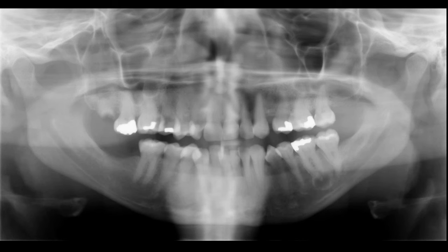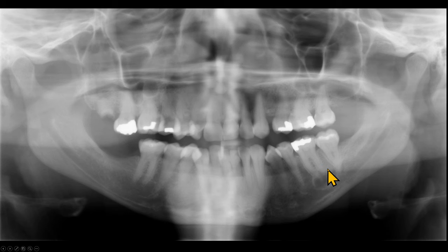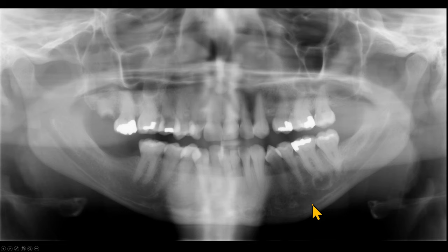On this panoramic radiograph we have a metallic restoration on the mandibular left first molar. When a vitality test was performed, this tooth was non-vital. Remember that a radicular cyst is the only cyst associated with a non-vital tooth. Superimposed over the root is a circular radiolucency with a well-defined border; the border is slightly thicker — we will call this sclerosis of the wall of the lesion.